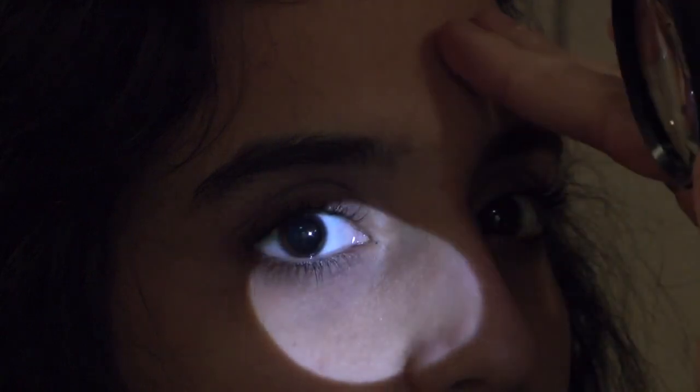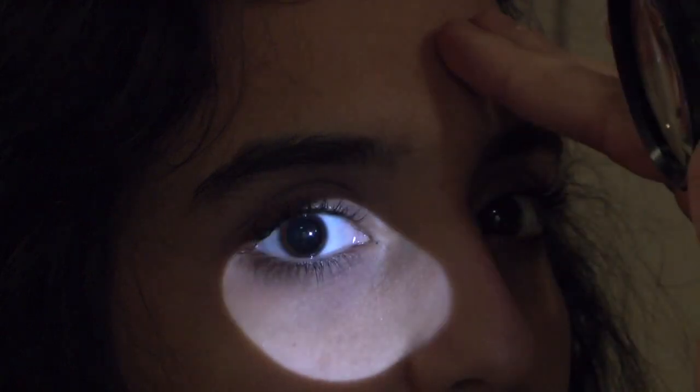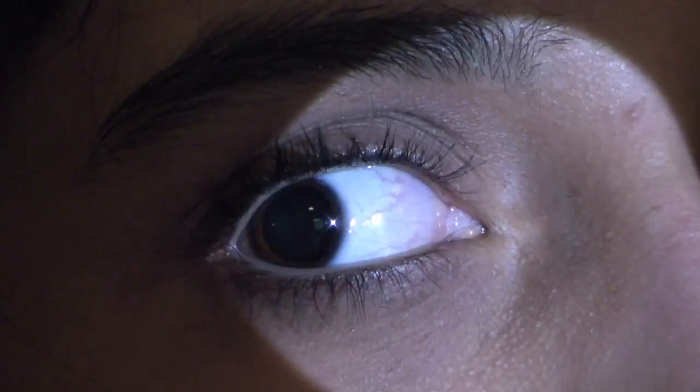You can also try tilting your head to the side, as this can allow the two beams of light from your headlamp to enter the eye without reflecting off the iris. Examine each clock hour, then examine the other eye.